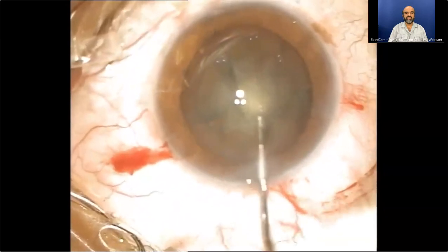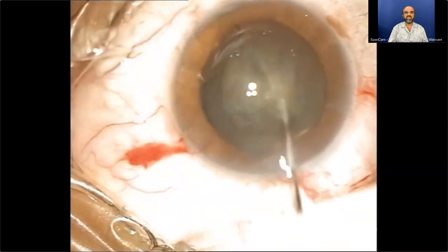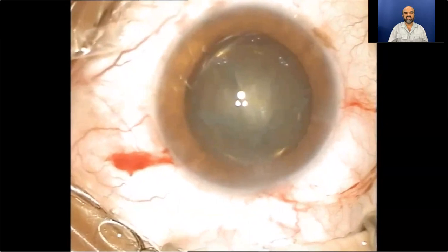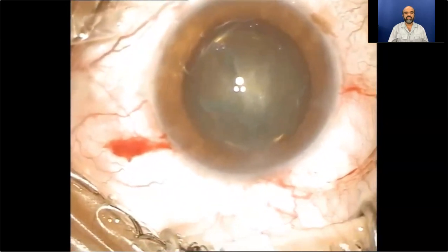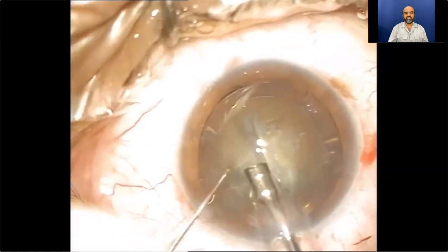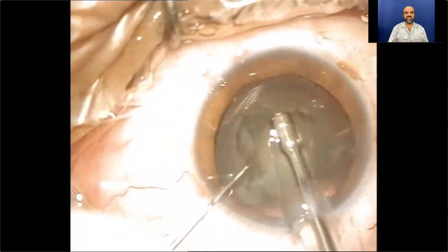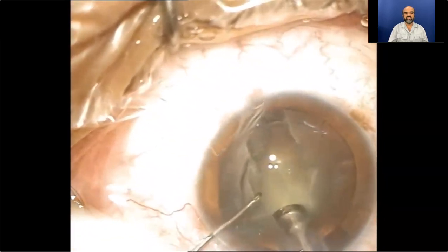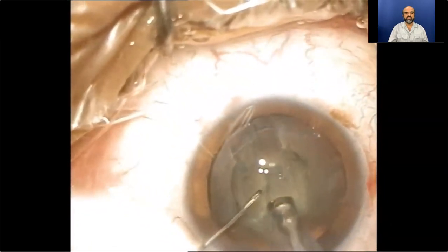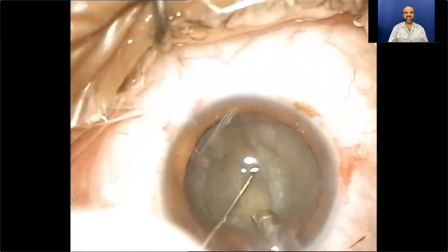Hydrodissection is performed little by little in each quadrant, followed by hydrodelineation, and there is a yellow ring sign. Generally I prefer the temporal approach for both eyes, but in this case I placed my incision at 12 o'clock position. The phaco handpiece comes into the picture and a little groove is prepared in the central tunnel.